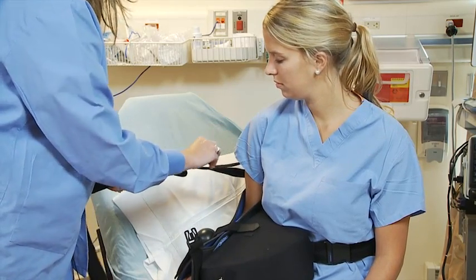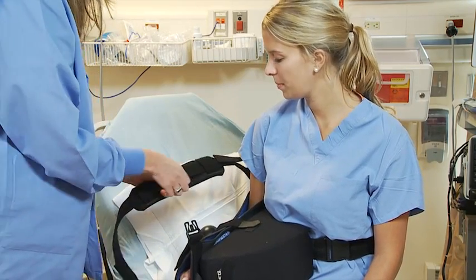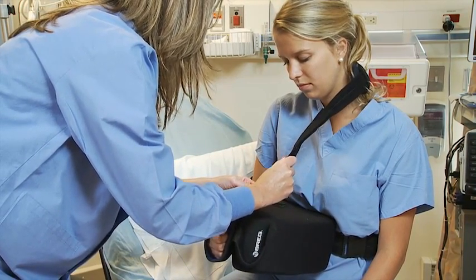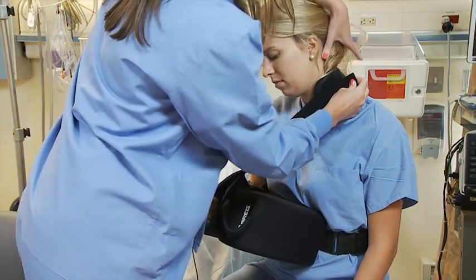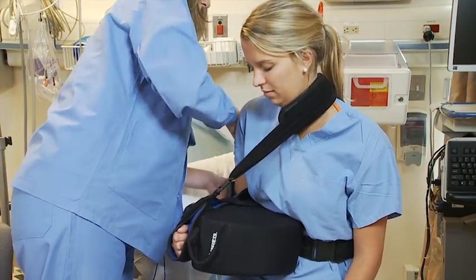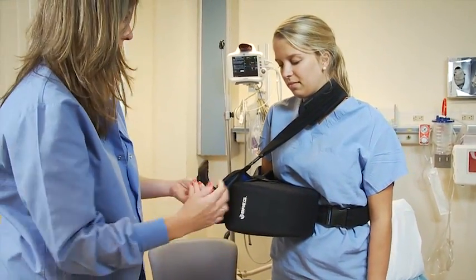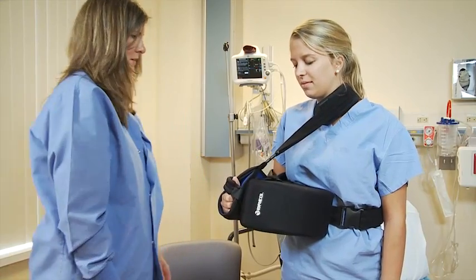This can be lifted — you can just lift up the velcro piece here and move it however you'd like so that the pad's behind your neck. Then you want to hook this right up here and secure it. You want to lift and bring it up to the velcro, and in the back same thing. You want to make sure your elbow's all the way back on the sling. You may or may not use the thumb strap, but if you were to use it, it's going to go up and under your thumb.